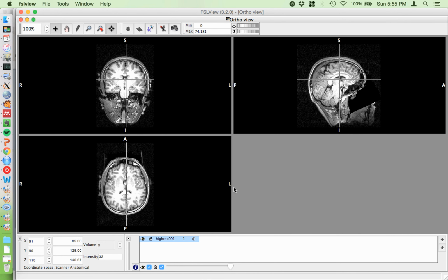There was a case with the scanner at one of the institutions I used to be at where for some reason, for some subjects, this weird thing happened and we did have to do that. But it turned out it was something that wasn't being set correctly at the scanner itself. So once we identified that, we were able to make sure that when we acquired the data, we could completely avoid this problem, because you don't want to deal with it.